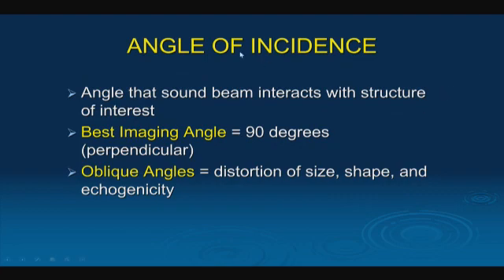All right, and now this is probably the most important concept out of everything we're going to talk about. It impacts everything that you do: the angle of incidence, or how you direct that sound beam into the structure of interest. The physics term is the angle of incidence equals the angle of reflection. You don't have to really remember that, but that is the physics term. And if you go to take your boards at some point, you will probably be asked that question.